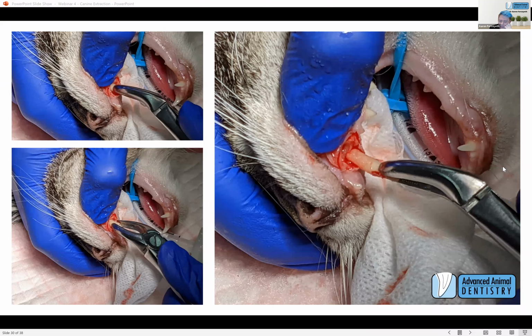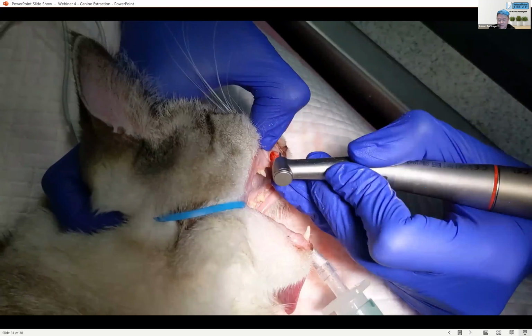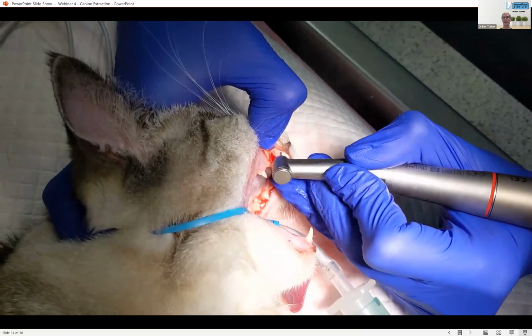We use lignocaine for our nerve blocks. That's the agent we use for this cat and for the dog previously. If this was the sole, so we're working in this arcade, both Beck and I tend to use caudal maxillary blocks. You could use an infraorbital block on this cat for this tooth. That should be actually quite an effective block for this area. But both of us generally solely use, I pretty much just use caudal maxillary. I find it easy to place.